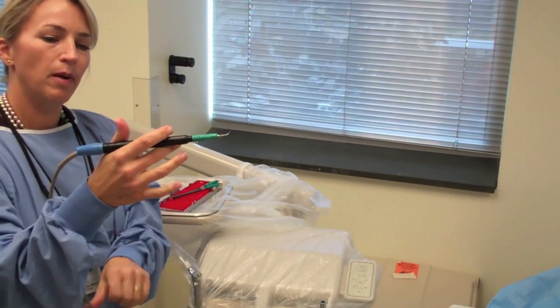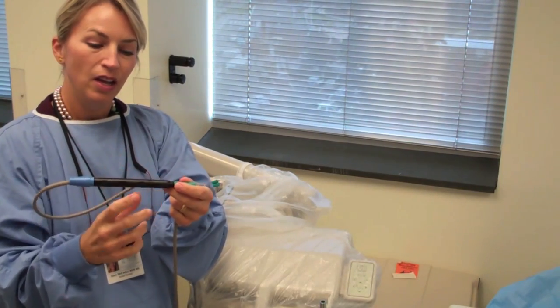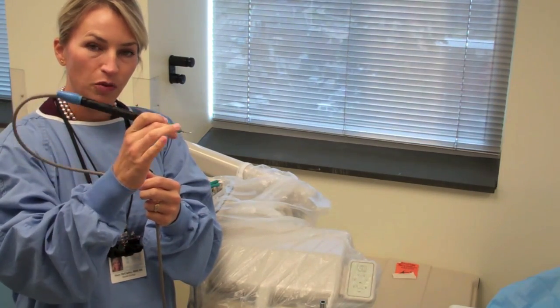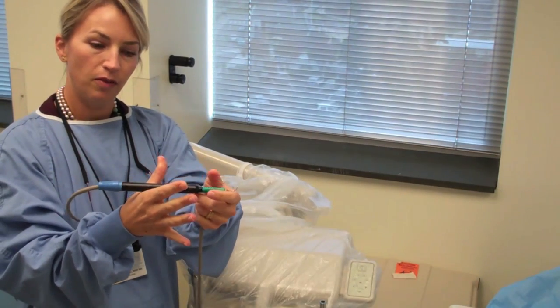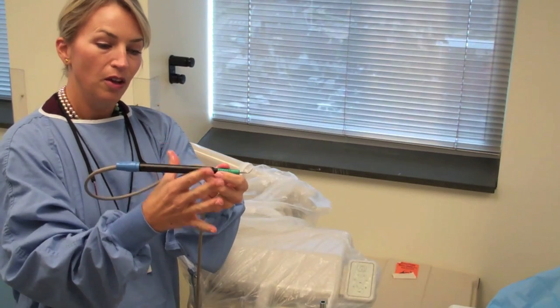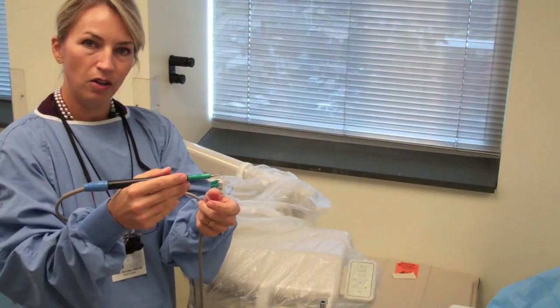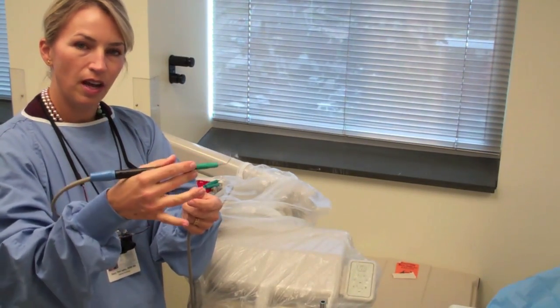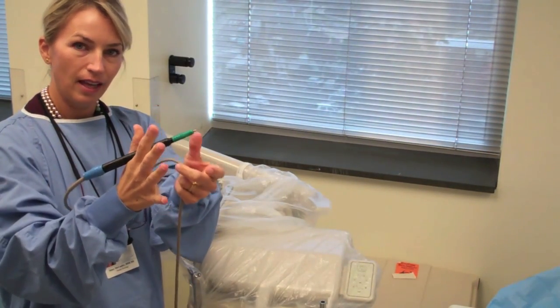The other thing to keep in mind is how you hold the actual ultrasonic insert in your hand. I know for myself, I tended to want to pinch the tip when I was doing my instrumentation. One of the things I recently learned at a faculty calibration is to actually have the ultrasonic resting in the web between your thumb and your index finger. So you have the insert between your thumb and your index finger, and then you just gently hold the ultrasonic insert like this. Then when you're using the insert, the entire time your hand is really relaxed. So it's not like this, it's like this.